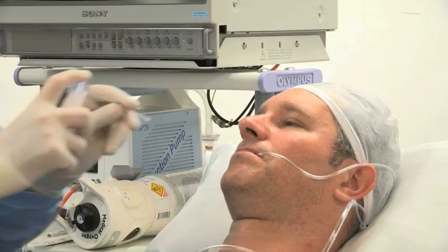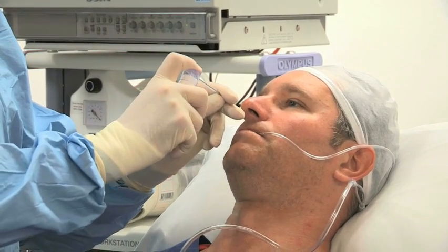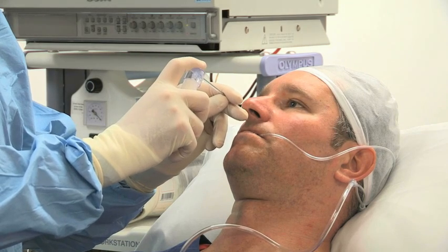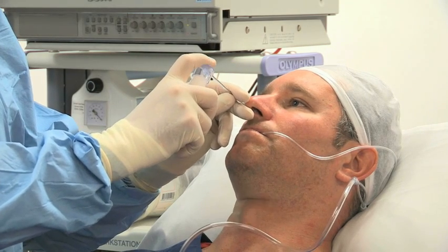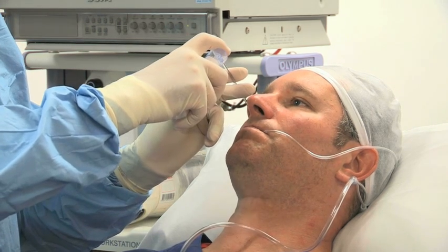Six metered dose sprays of a combined local anaesthetic and vasoconstrictor, such as co-phenylcaine forte, should be used in the best nostril whilst asking the patient to sniff deeply.